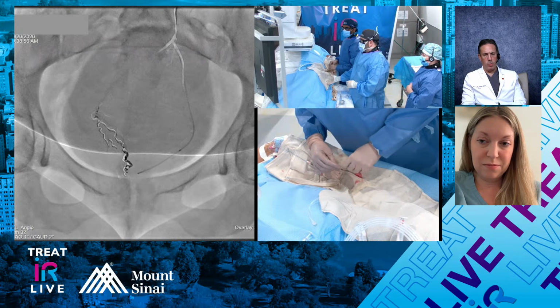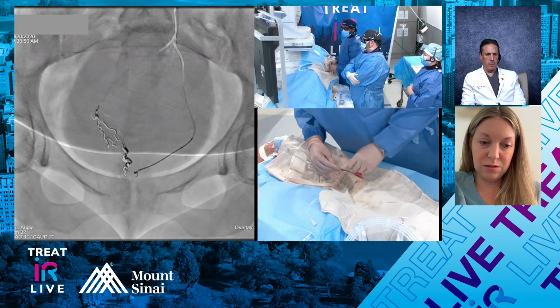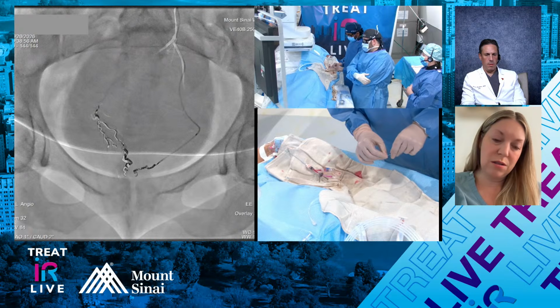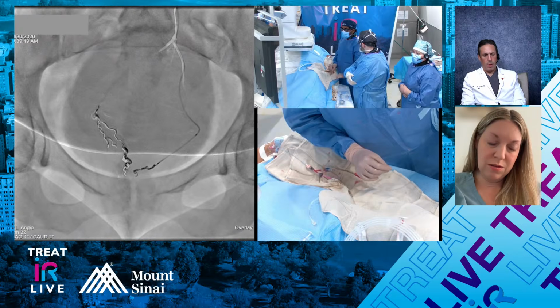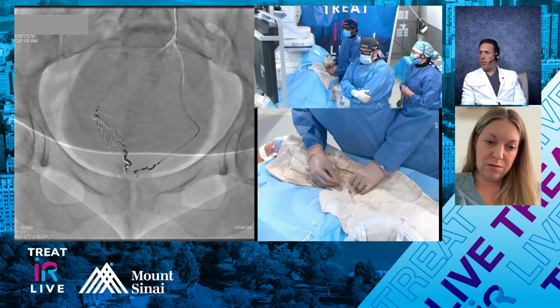What size coil do you have here? I would assume it's a 2, but you tell us. Back to the 2/8 soft. Great. Let's see. It's forming nicely here. Looking good. We might place another one because we're kind of selective here. Do you want to do the same thing again? Same 2.8 or 2.6 or longer? Probably do another 2/8. But I'm gonna do a puff when I see.